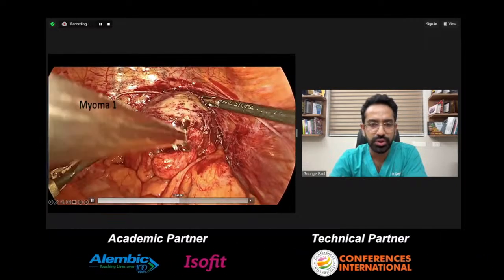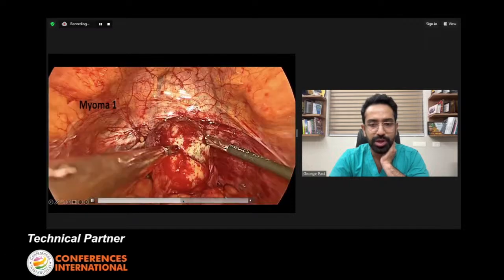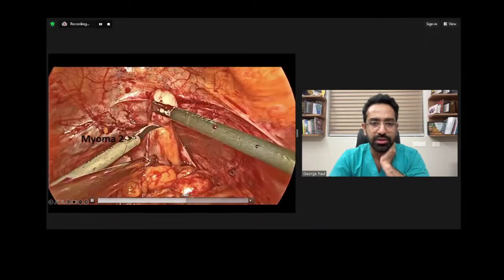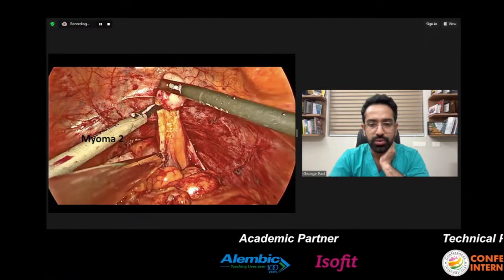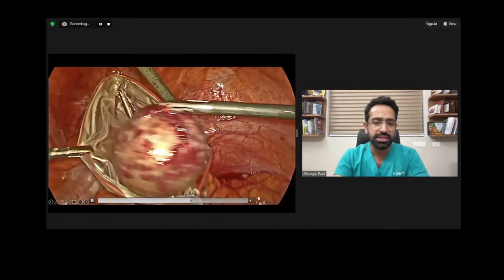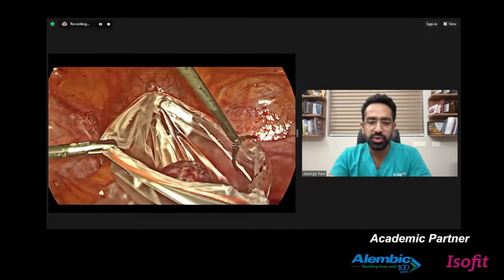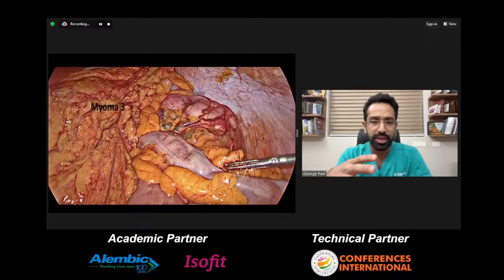So in total, I think we took about 7 myomas. This was the first one, myoma number 1, and then another small one along the rectum that was taken out. Since we were expecting multiple ones, we put in an endo bag just so that we can collect these myomas into the bag and not lose them.